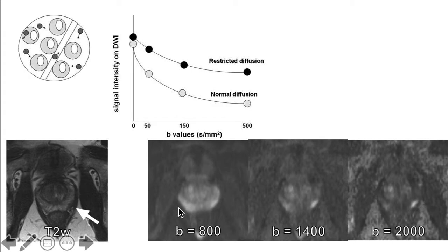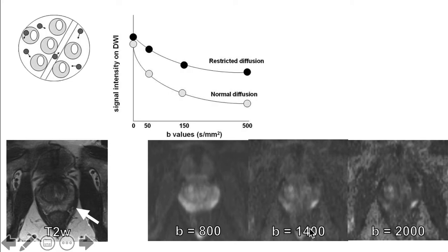Note here that we have a suspicious hypo-intensation in the peripheral zone on the left. But if we use a B value of 800, we are not sure if this is indeed an area of restricted diffusion or not. But if we use an increased B value, the area which initially had a T2 shine-through is now relatively less in signal, making our lesion stand out even more so with a higher B value or B value of 2,000.